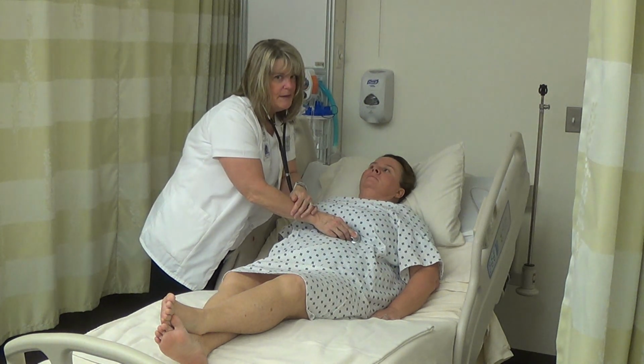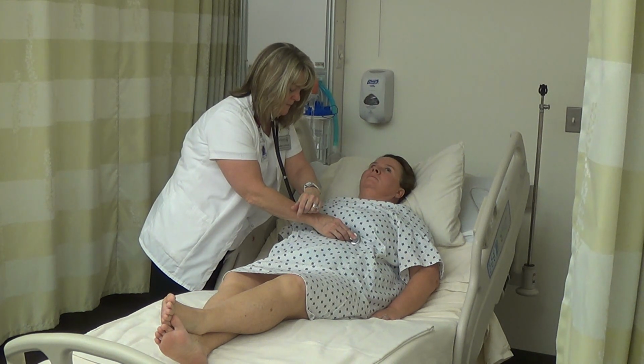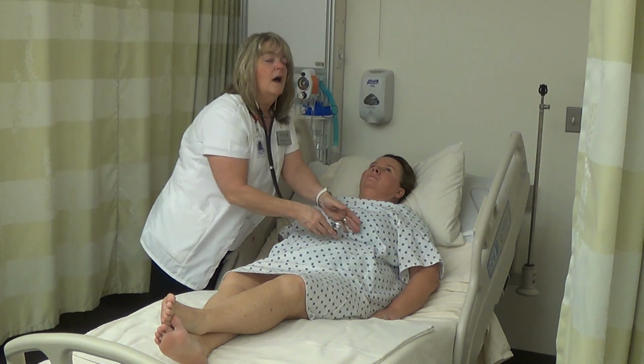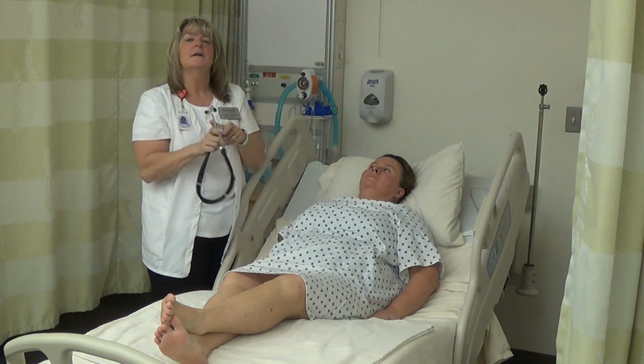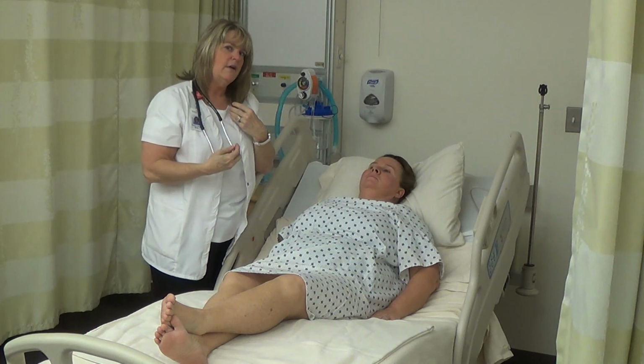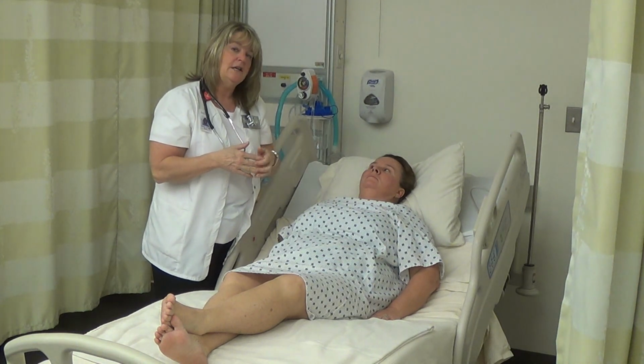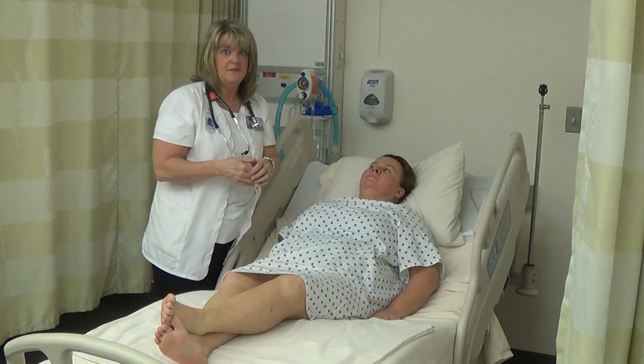Now this is where you're going to spend a full 60 seconds, again listening to rate, rhythm, and volume. Don't spend less than 60 seconds, because if you have a patient who has an irregular heart rate, maybe due to a dysrhythmia, you may miss that, or you may not be able to hear the heart murmur because you didn't spend enough time listening.